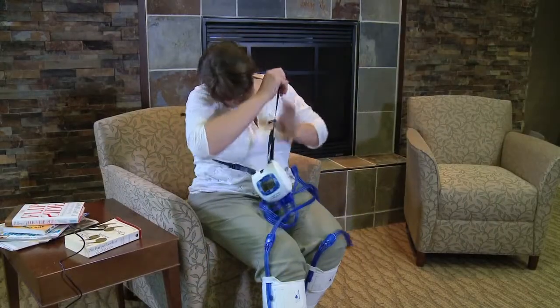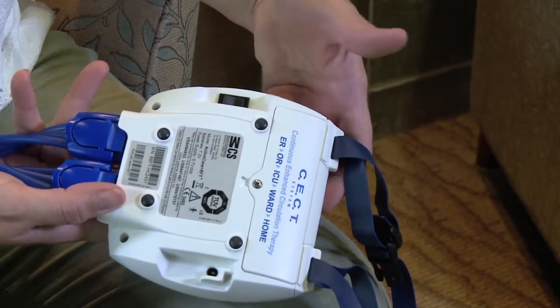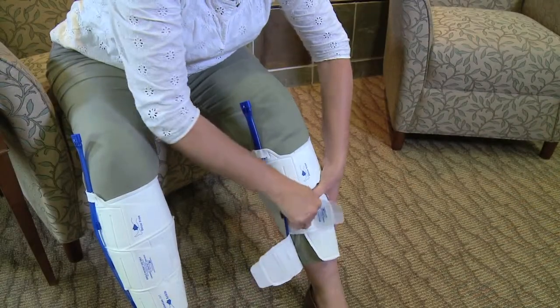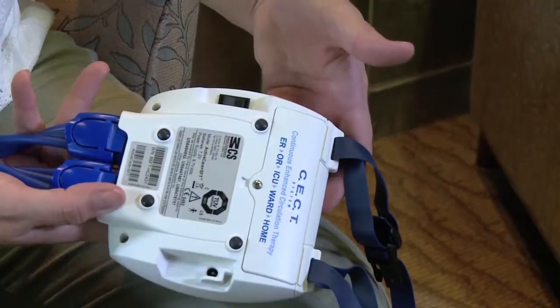If you need to take a break for bathing or skin checks, turn off the device and remove the sleeve. Do not leave the unit running when you take it off. To resume use, place the sleeve on your leg as instructed earlier, then turn on the device.